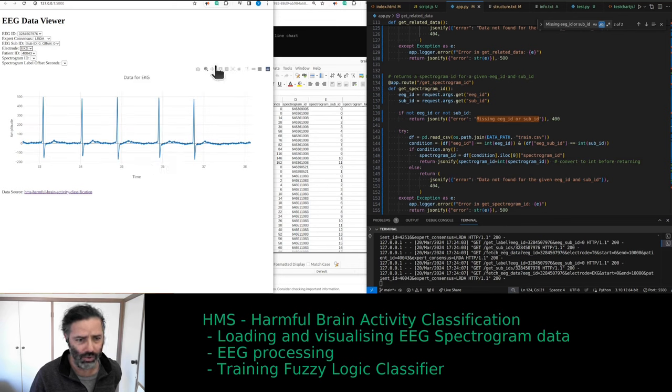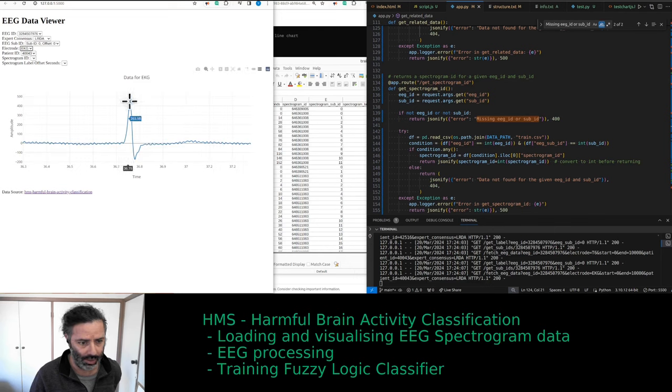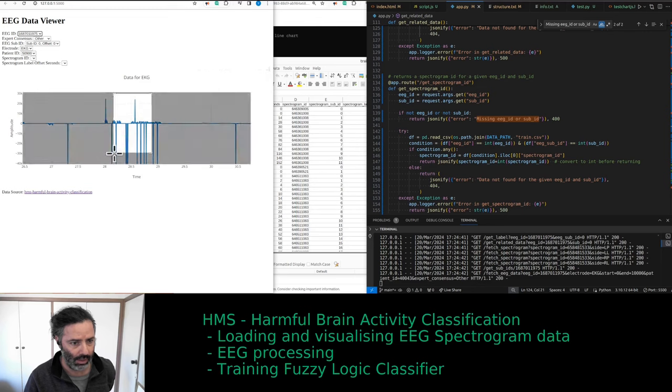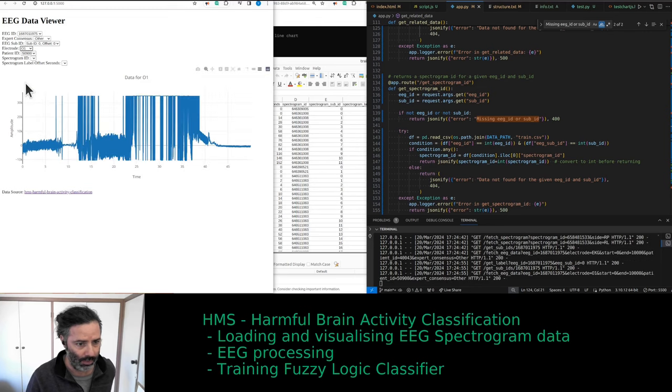It looks like a low resolution, like low sampling rate. You only have a few samples. But I've seen way worse ECGs with this dataset. Ooh, it's good this one is labeled with other. When you see stuff like this in one of the channels, you can probably guarantee that other channels will be wrong.